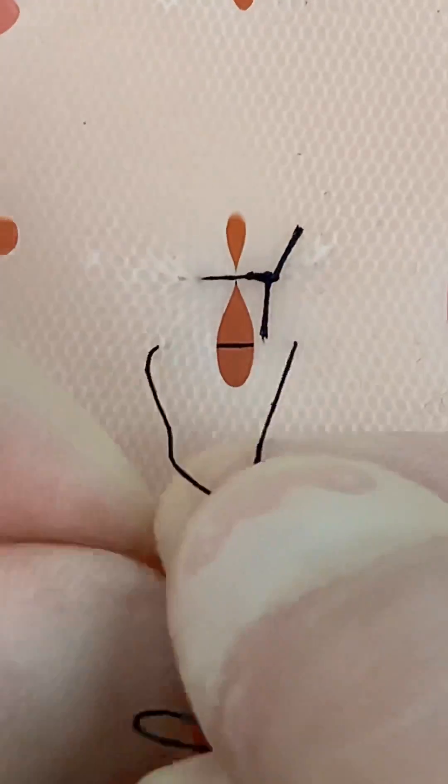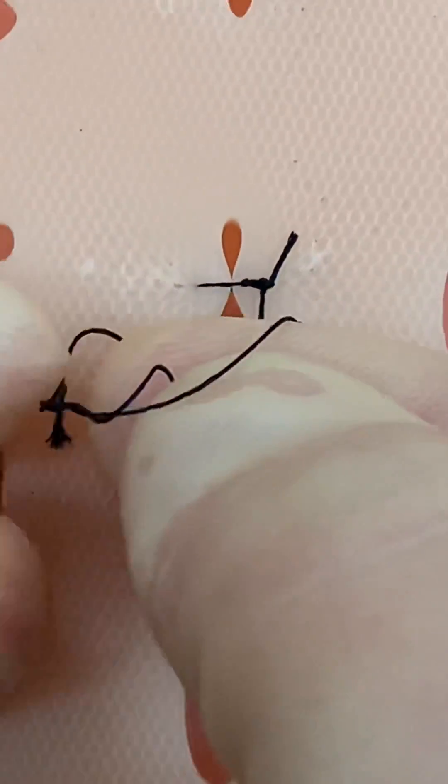I would also need to be more focused to remember which end of suture material I pulled over which, as each knot needs to be tied opposite to the first to maintain a square knot instead of a granny knot.